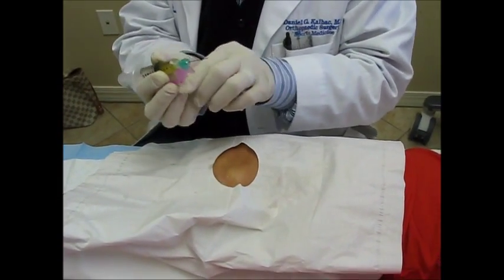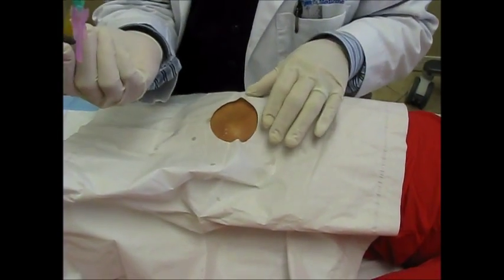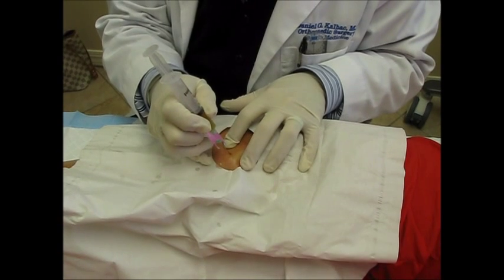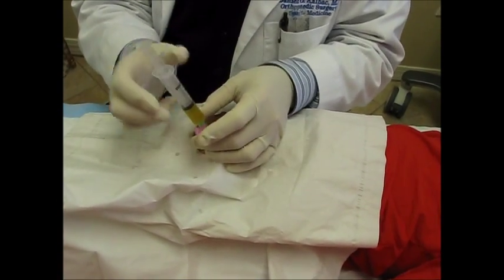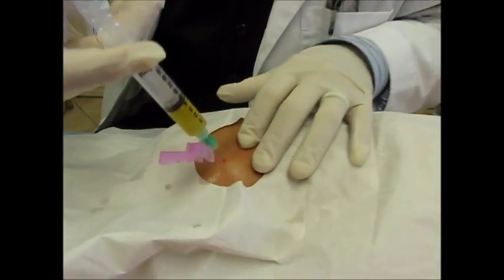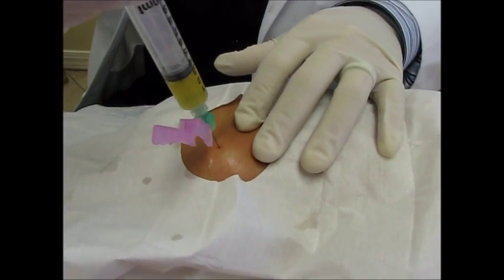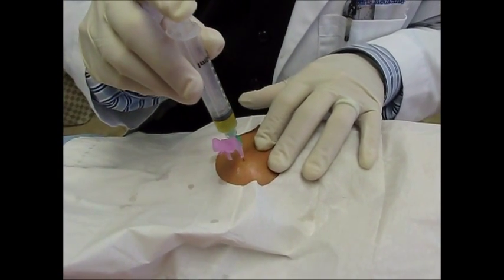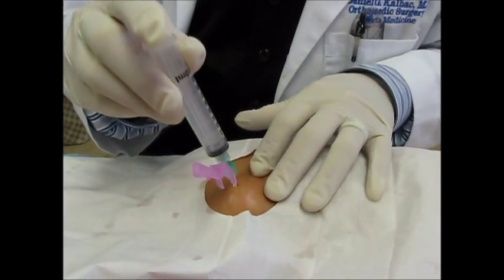So the plasma — get the air bubble out — it's a little bigger needle, so you definitely want to put the lidocaine in first. Now I inject; she should not feel a thing. She may feel a little bit as I go all the way down to touch the ligament, which is right by the bone. I aspirate to make sure everything's okay. I can feel when I'm touching the bone, and if I'm touching the bone, I'm touching the ligament. The key difference from cortisone: you don't want to put cortisone anywhere near a ligament or tendon — you put it around it. This goes right into the ligament because it has the healing properties.